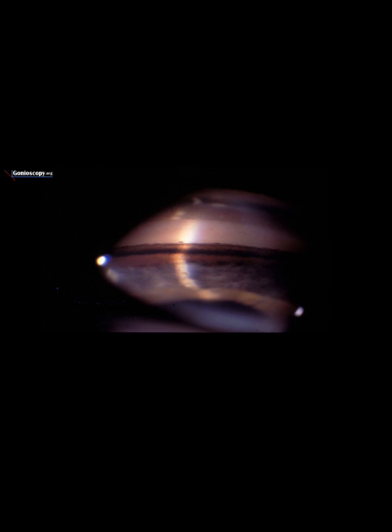Patient with pigment dispersion, so this is an E, extremely deep. This is all ciliary body face right here, way more than 50 degrees, concave, 4+ pigmentation. So E60C4.